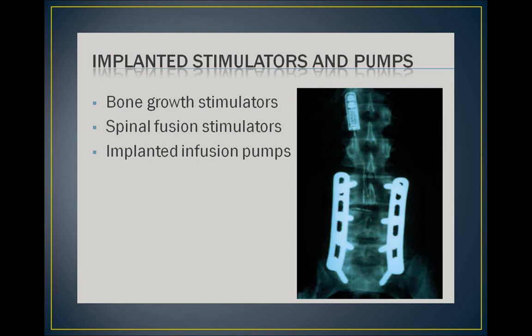If they are broken, they could become heated, or an arcing effect could occur in the wires and the patient could be hurt. In the X-ray shown above, you can see that a spinal cord stimulator is at the top of your image, and its wires are leading down to the spine into the fused area. If the X-ray shows a broken wire, the patient will not be allowed to have an MRI.